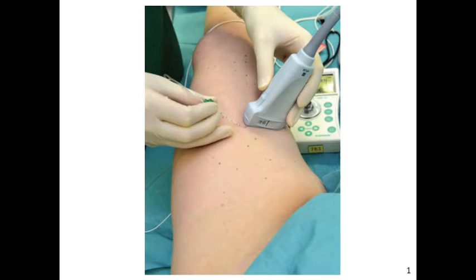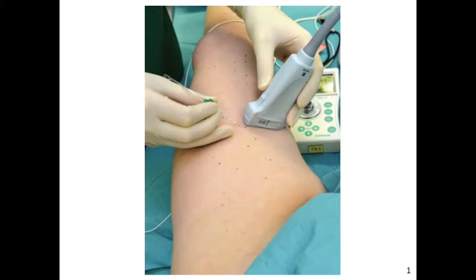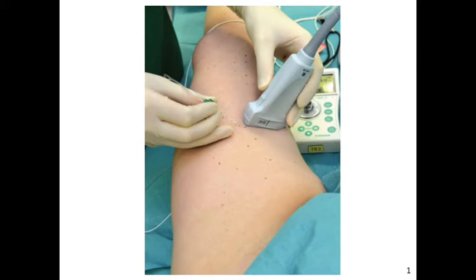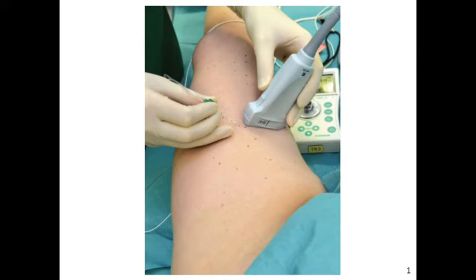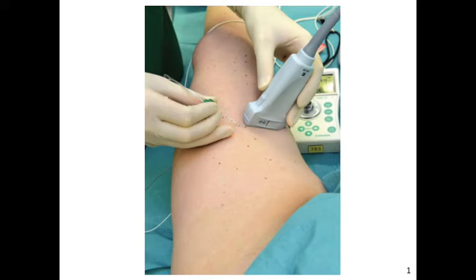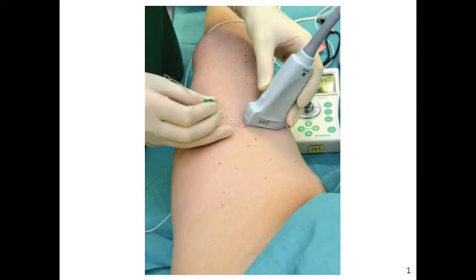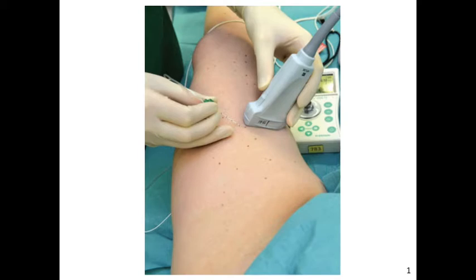To identify the landmarks needed for this block with ultrasound, the patient can be placed supine with the leg externally rotated. Place the probe transversely at the mid-thigh in the medial region and scan the medial mid-thigh and distal third of the thigh. The key is to identify the fascial plane between the vastus medialis and sartorius muscles, which should contain the distal branches of the femoral artery as well as the saphenous nerve.